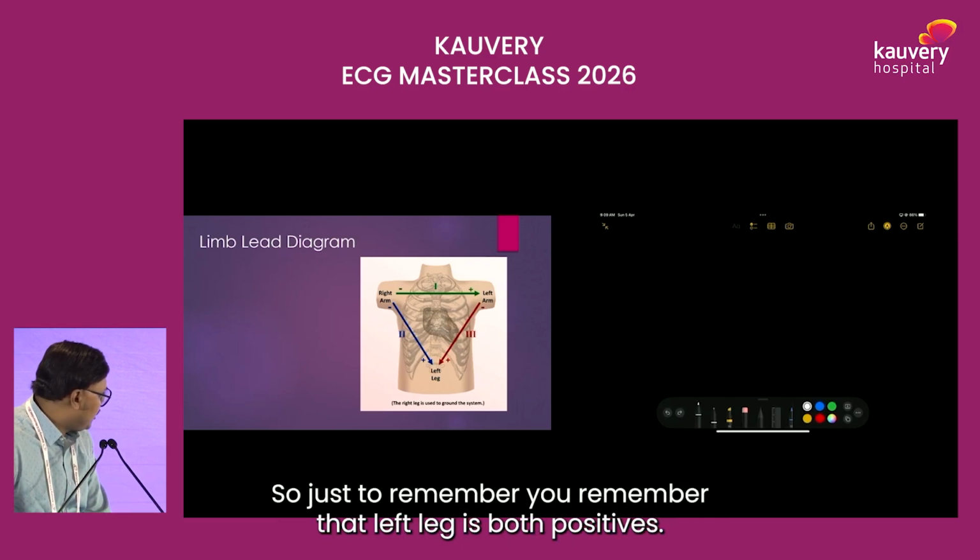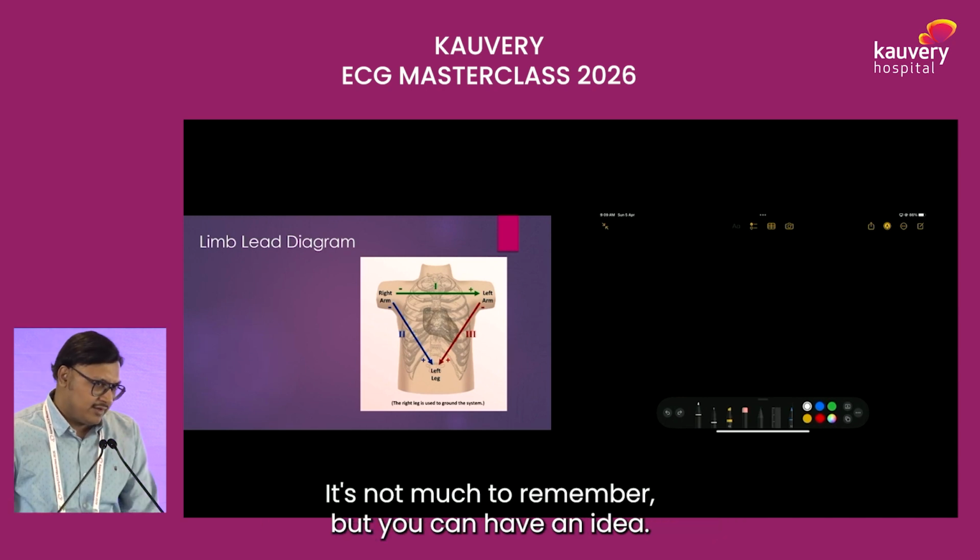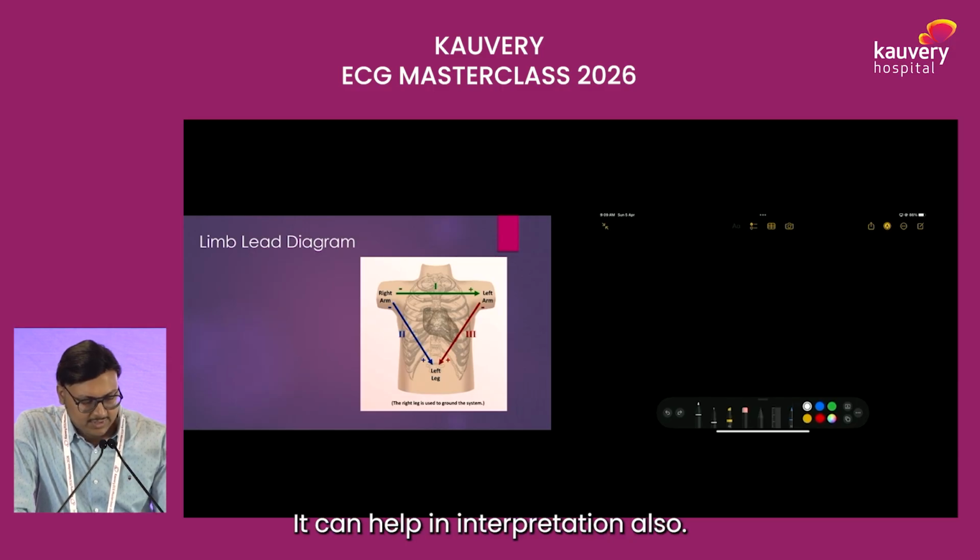So just to remember, the left leg is positive for both. Left arm is positive for lead 1 and negative for lead 3, and the right arm is negative for both. It's not much to remember, but you can have an idea. It can help in interpretation also.